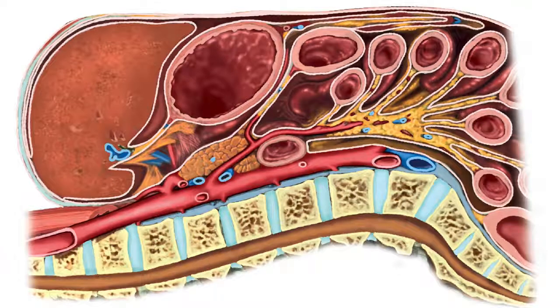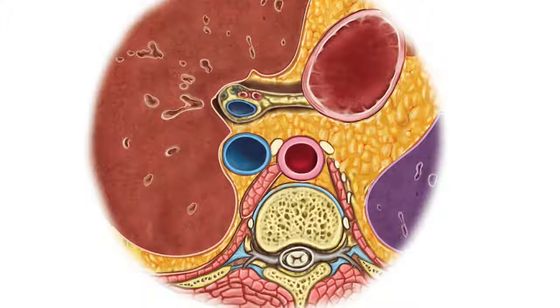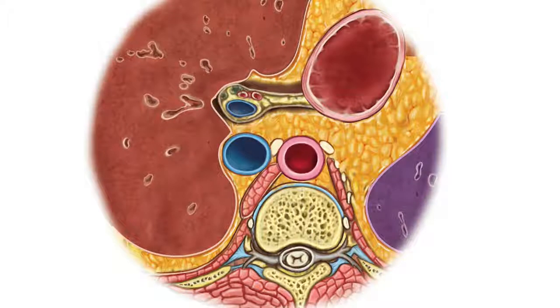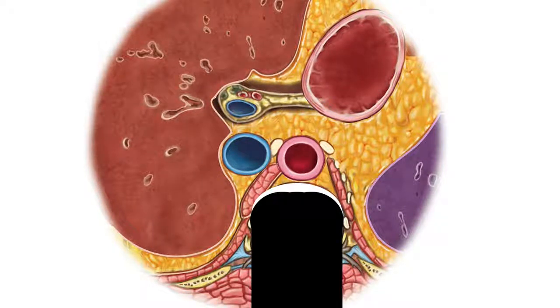Key parts of the exam is identifying the aorta. The aorta runs along the spinal column to the left of midline. You can see here on this transverse view, we can see the spinal stripe, identify the vertebral body. That will help you identify the aorta. You are not necessarily looking for the aorta at first, you are looking for the spinal stripe, which will help you identify the aorta.